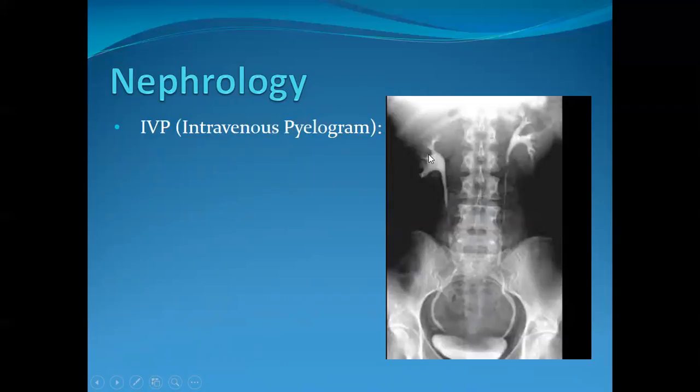Primarily, it's been used for renal stones, to look for hydronephrosis, to look for renal stones. And some individuals actually say that these types of examinations will help push the stone on out because of the weight of the contrast. I've heard urologists say that before. I haven't really seen it in the literature, but oftentimes, especially your older urologists will use IVPs to help maybe get that stone on out of the ureter and prevent somebody from having to go to surgery to have it taken out.